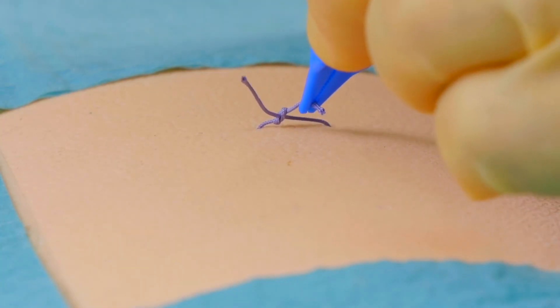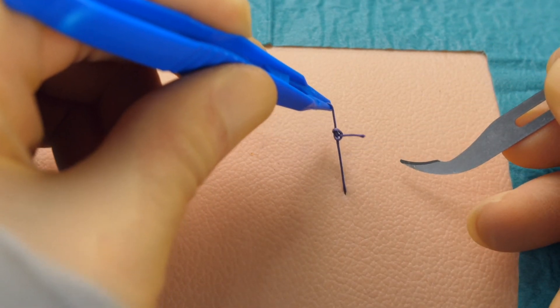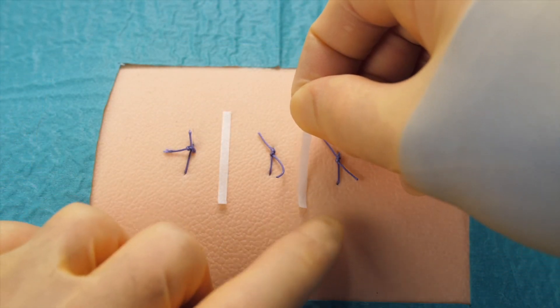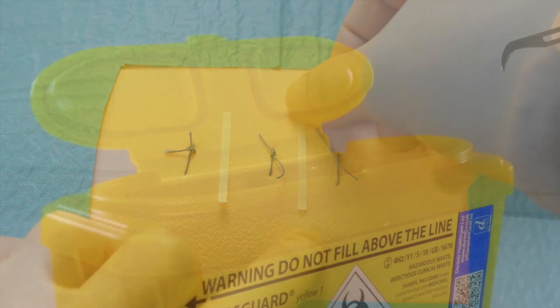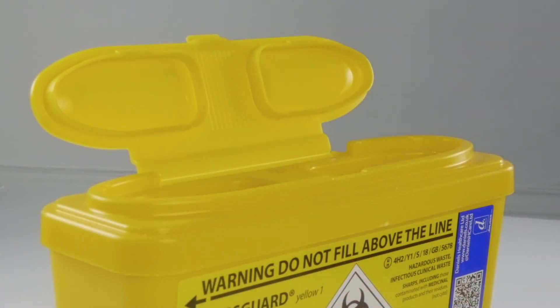If we are unsure as to the strength of the wound at the time of suture removal, we may choose to remove only alternate sutures, or even support the wound by using adhesive surgical tape. Having finished removing the sutures, we then safely dispose of the curved blade suture cutter in the sharps disposal bin.